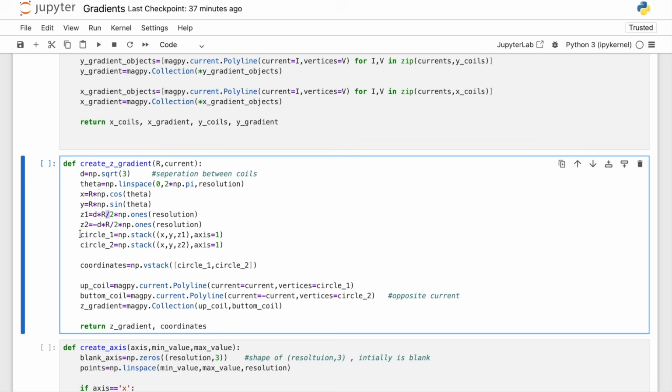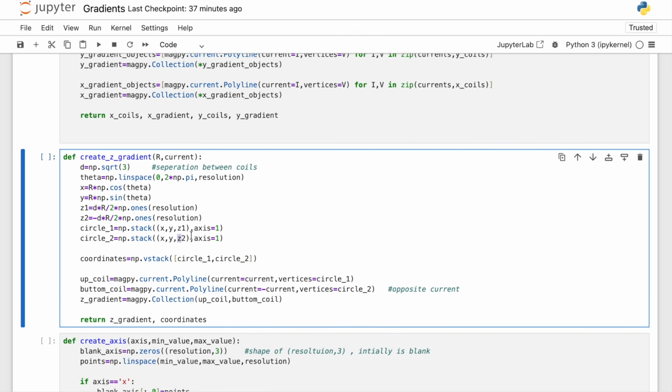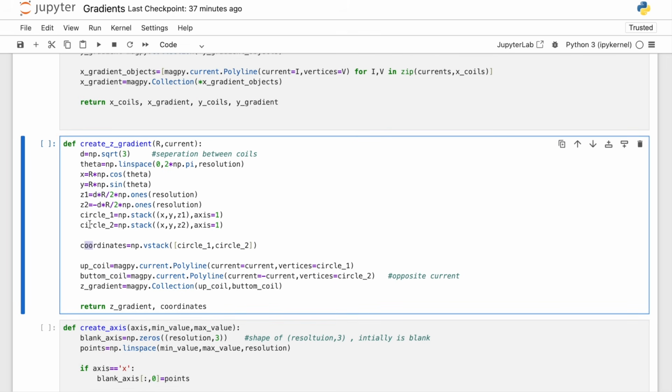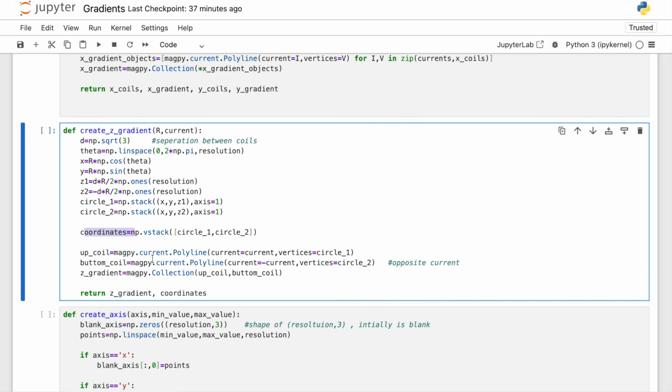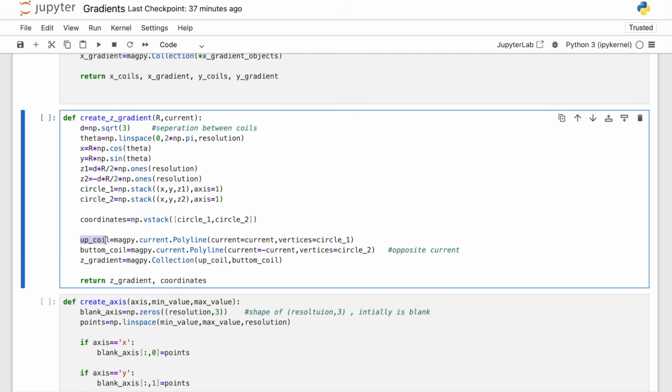And similarly, my circle 1, which is the top coil's coordinates, are just x, y, z1 stacked together, and circle 2's coordinates are x, y, z2 stacked together, and the total coordinates is a stack of circle 1 and circle 2. So this is the full coordinates of my z gradient. My up coil, which is now a magnet object, is created again using the polyline function.